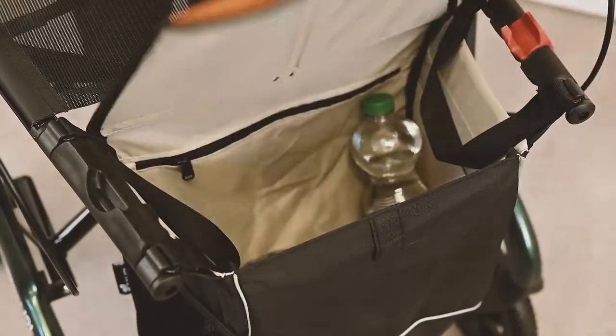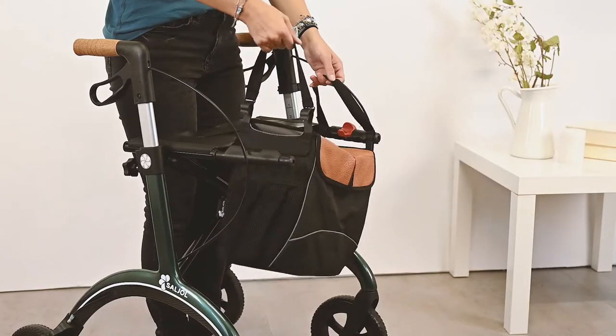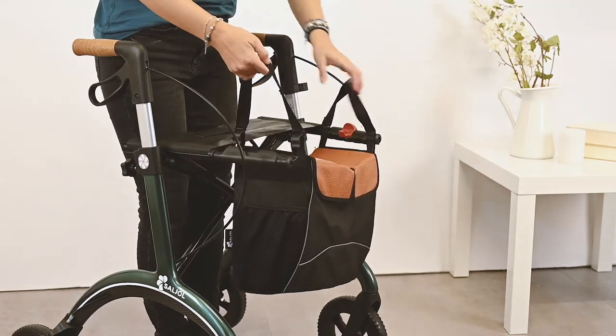The light colored inside coating makes it easier to find objects of value. The bag can be easily removed and reattached to the rollator.